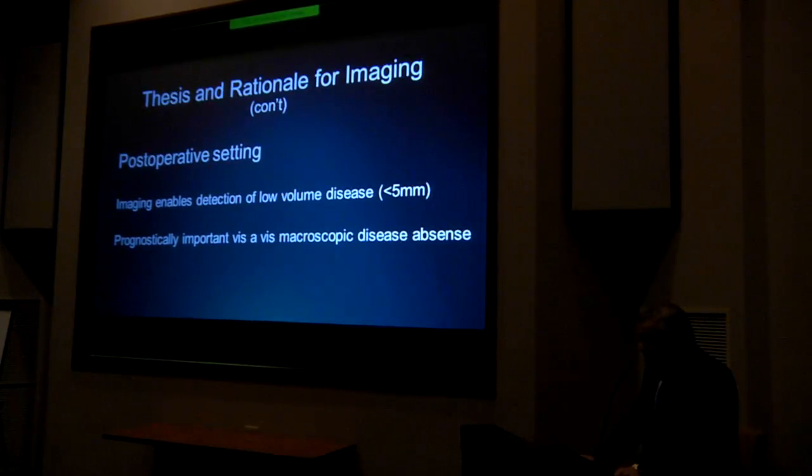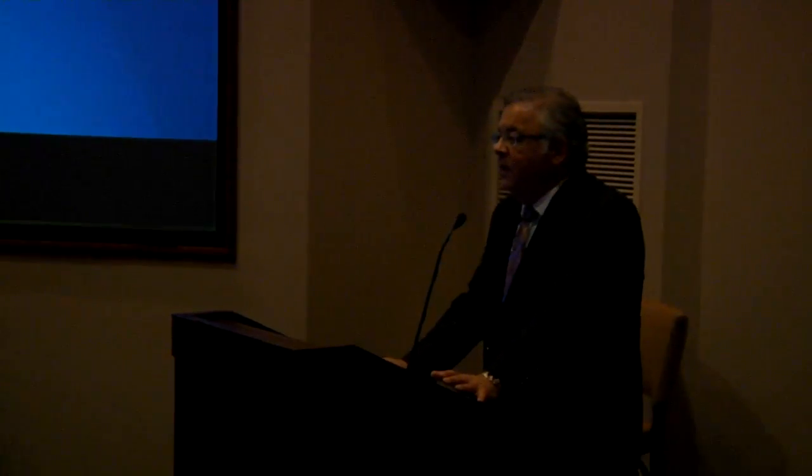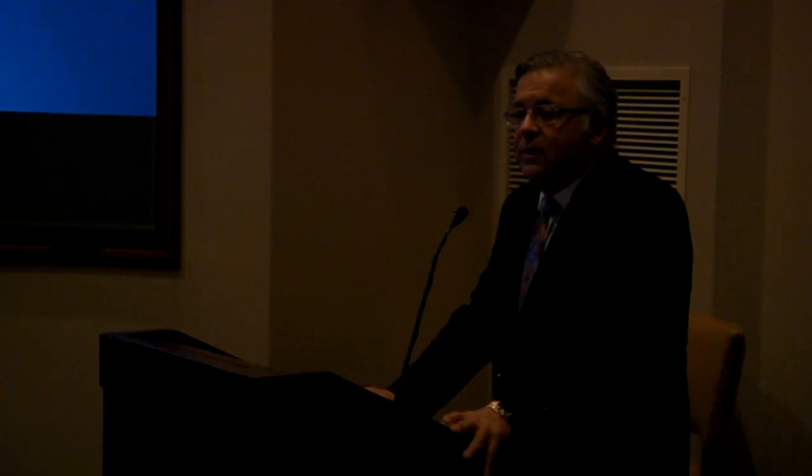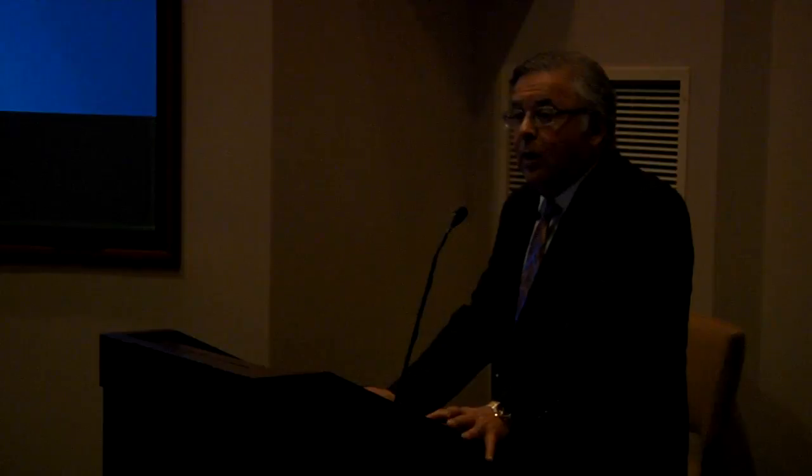Postoperatively, we think that imaging enables detection of low-volume disease, and as a radiologist, it's really about the low-volume disease. Dr. Sugarbaker and I were talking before, about 7:30 this morning, and he made the comment that imaging is tough. Not that my job is tough, but it's hard sometimes to produce credible results, because the oncologist is looking at the patient's overall well-being, at tumor markers, and at the results of imaging, and we'd like to see the three match, and they don't always. So we do our best to identify low-volume disease, which we classify as less than 5 millimeter disease, because it's very important prognostically.